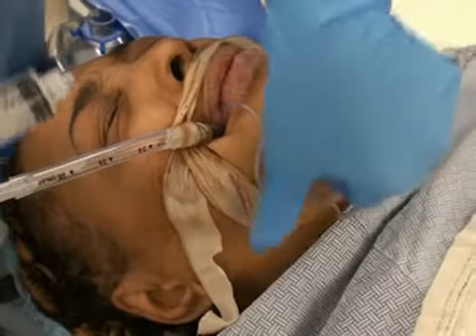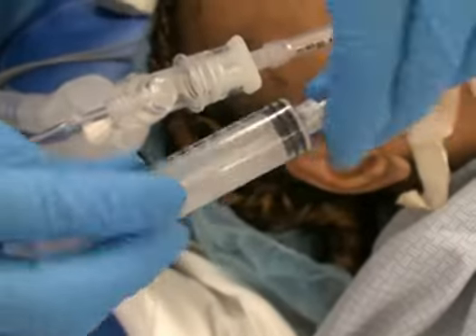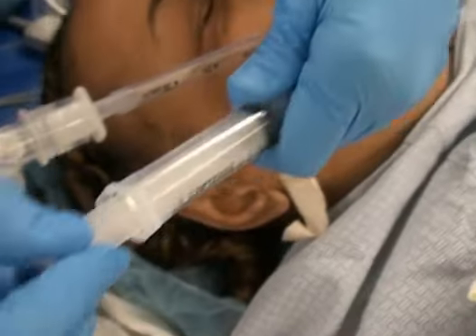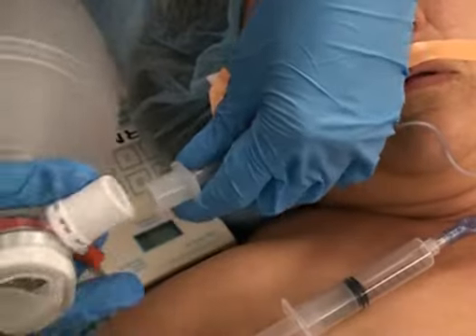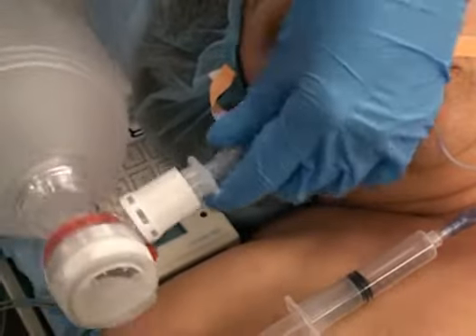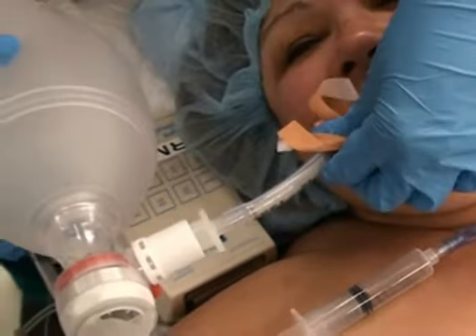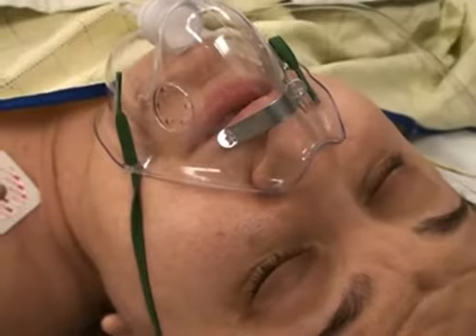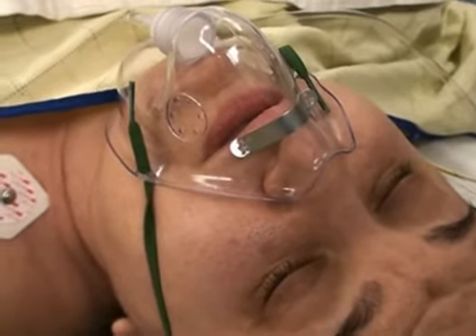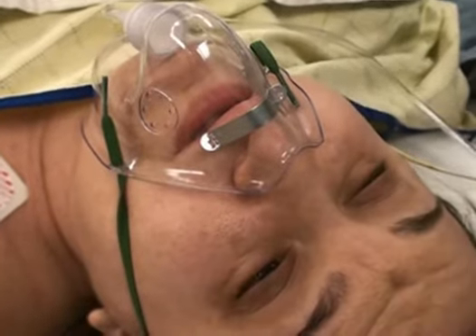When the patient is ready for extubation, attach a syringe to the pilot balloon and completely deflate the cuff of the endotracheal tube. Positive pressure ventilation with oxygen can be provided with a bag valve device during endotracheal extubation to maximize alveolar recruitment. After extubation, immediately verify that the airway is patent and that adequate spontaneous ventilation is occurring.